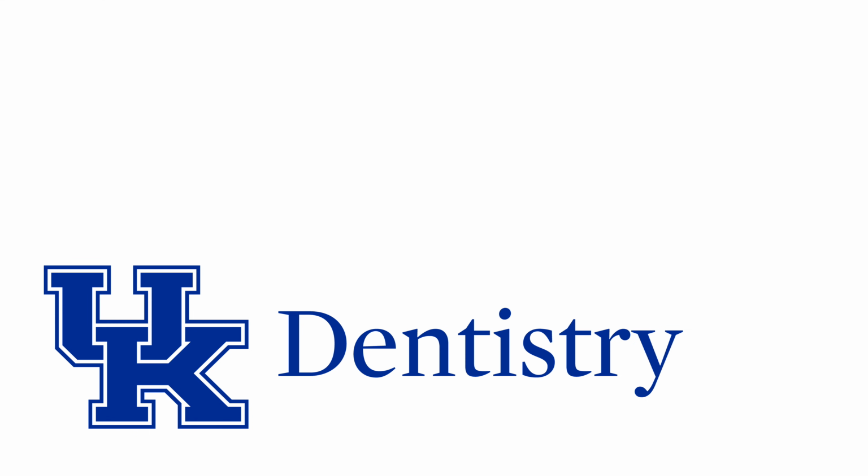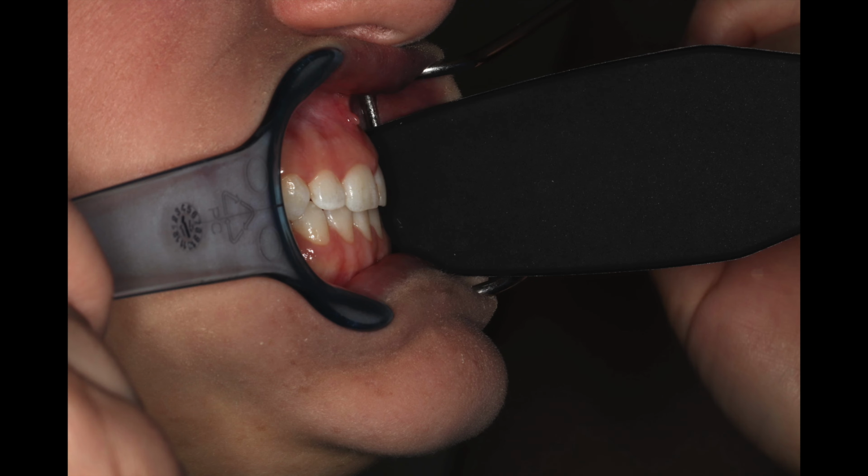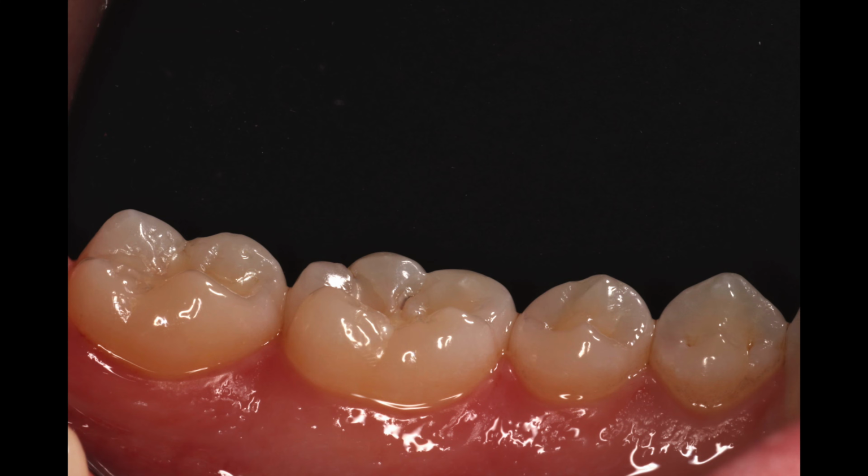This concludes the standard set of intra and extraoral photography that we take at the school. Other shots can be taken based on the clinical interest. Additionally, some photographers like to use contrasters to block soft tissue or contrast colors. Here is an example of the mandibular lingual shot using a contraster.